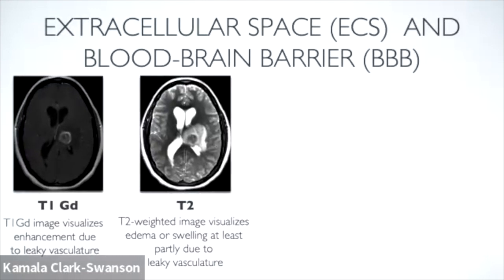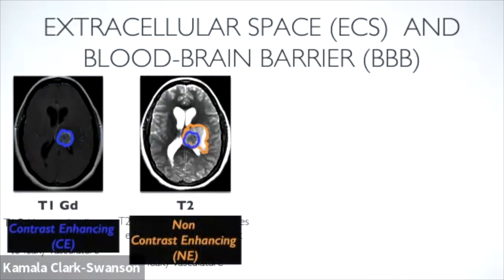Just to get some terms, I think Lee did a great job earlier talking about terms we use when we look at the imaging and the phenotype of the imaging. I'll skip through this quickly, showing contrast enhancing as well as non-enhancing regions. Contrast enhancing is determined by the T1-GAD, again, for that contrast agent. Non-enhancing regions are those edematous regions that are outside of the contrast enhancing region.